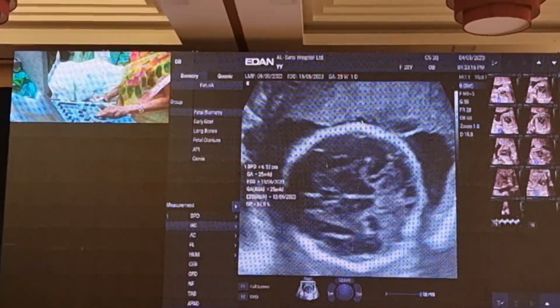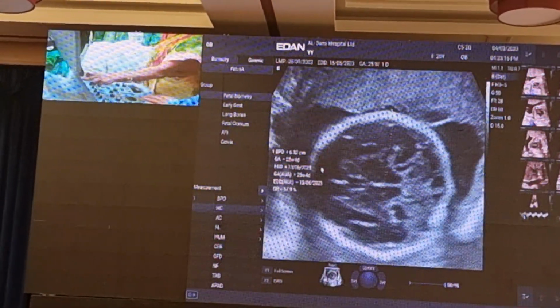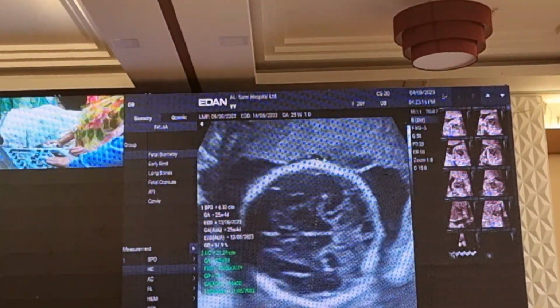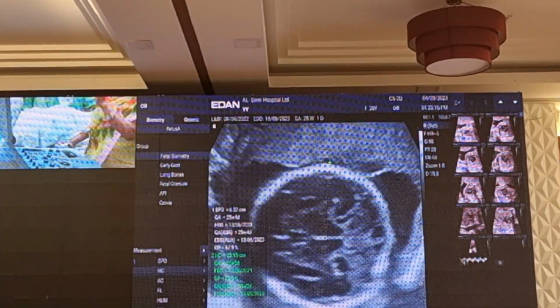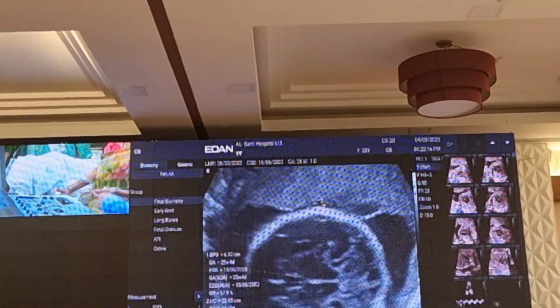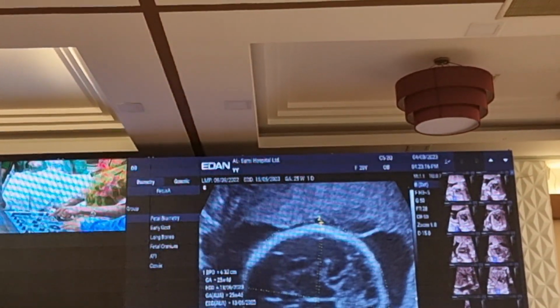Okay, so here we are looking at a BPD. We will also do an HC, and we can also just point out important landmarks before we move out of this patient. Okay, so that's the BPD section. We have taken the biparietal diameter, we have taken the head circumference with the important structures. Just remove the markers.